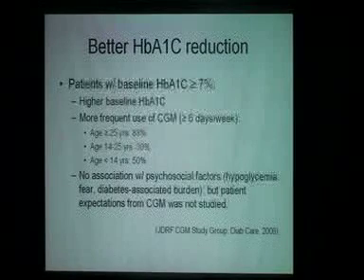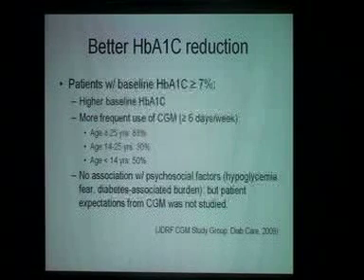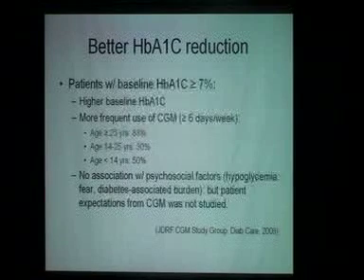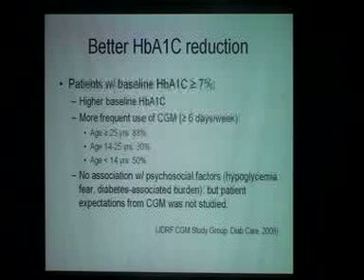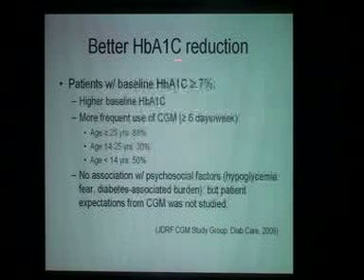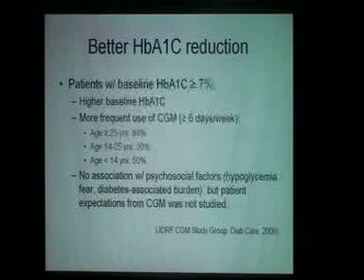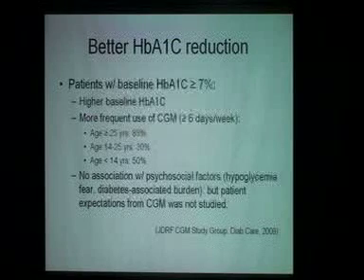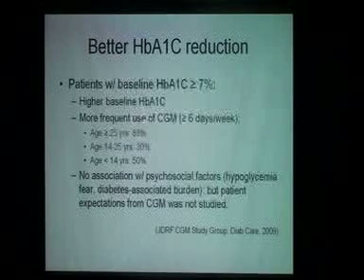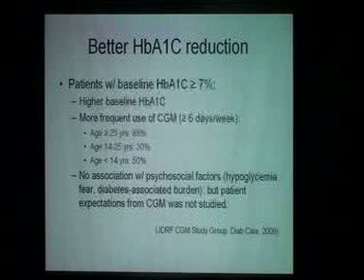Now, this is how frequently they use the CGM. But who got the better results? So was it helpful? Did that make any difference in their A1C control? Again, you recall the patients were a group that had A1C of more than 7 at baseline, and the other group had less than 7. So in the patients with high A1C, the ones that had higher A1Cs at the beginning dropped their A1C more at the end of 6 months. So they got basically the best benefit. Now remember, these are patients with A1Cs between 7 and 10. But the higher, the better benefit. And obviously, the ones that used CGM more frequently had the best reduction in their A1C.